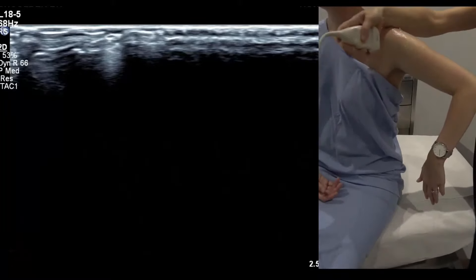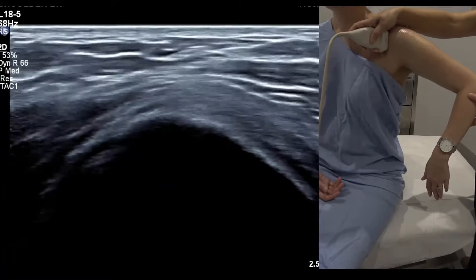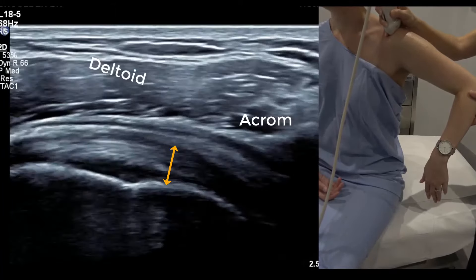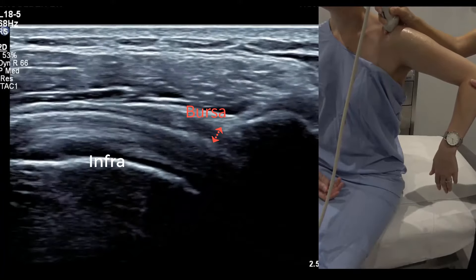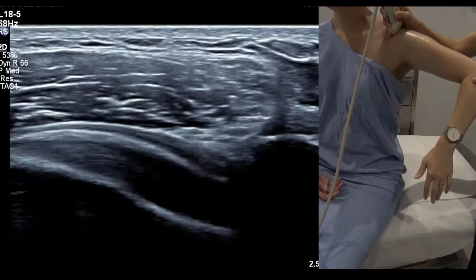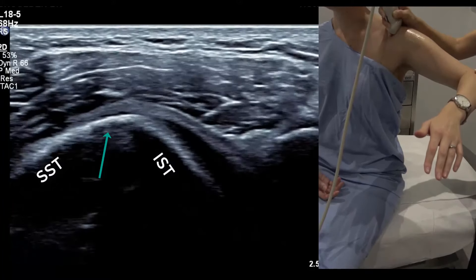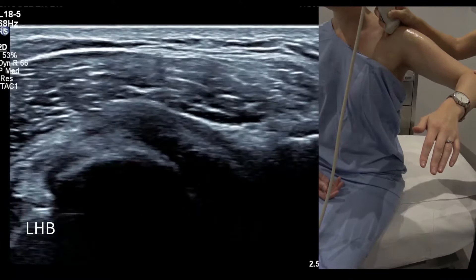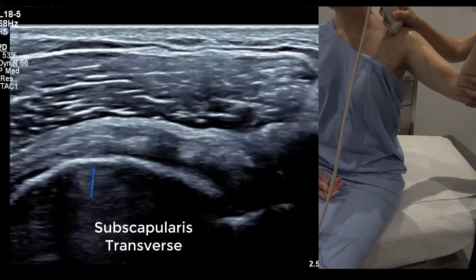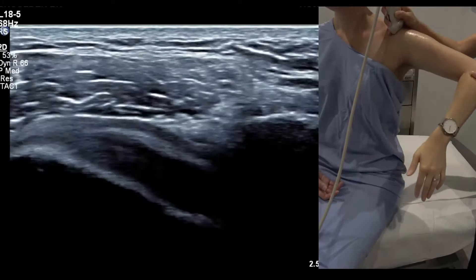Ergonomically, rest your ulna on their shoulder and sling your hand over. Find the bicipital groove again — superior facet showing, then middle facet. Slide back until you find some acromion, showing the cuff disappearing underneath. The tendon is infraspinatus in long. Get the patient to transition up to a stop sign position. That little bony knob is the changeover between superior and middle facets. Going medially: supraspinatus disappearing under the acromion, then biceps, then those three little bundles of subscap — they pretty much make it under the acromion as well.